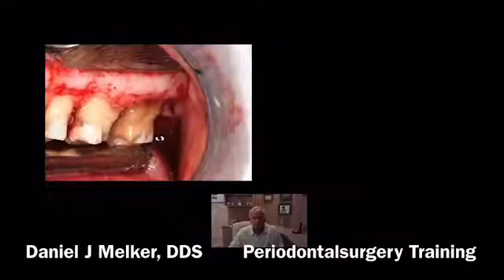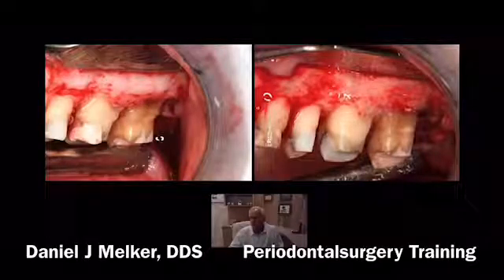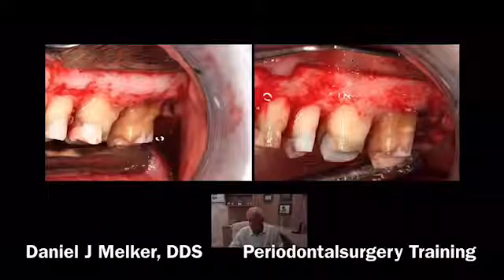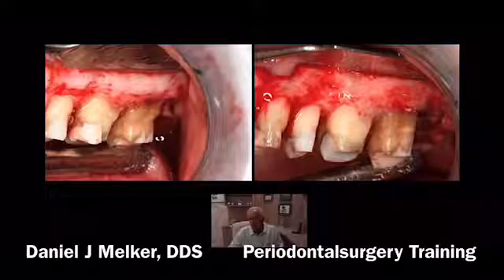Here's the bone before — notice we have shoulders. If my restorative dentist had placed a core out here, I would have been fine with that. But because they're so close to the furcation, I'm going to want to remove these shoulders. When we talk about biologic shape, it's going to be much more than just whittling on the tooth. We've done our massive osseous surgery and created a parabolic architecture, and we also removed these shoulders.